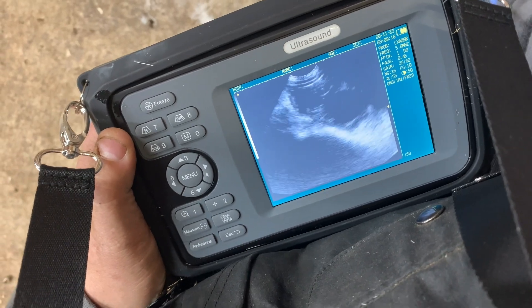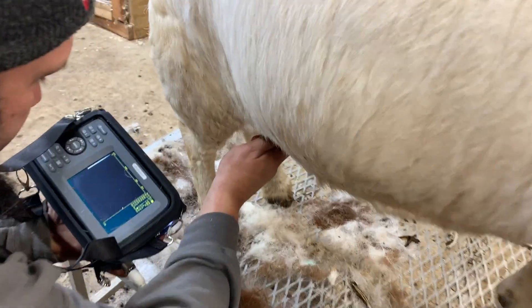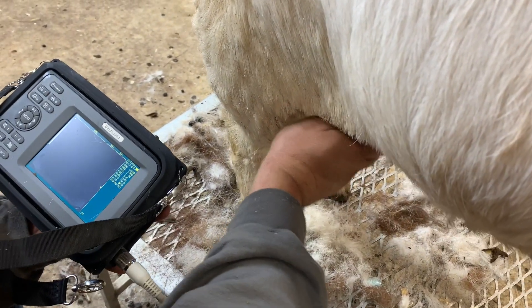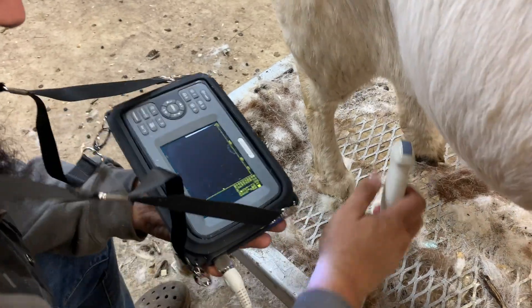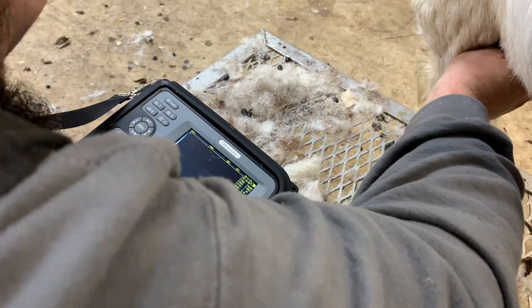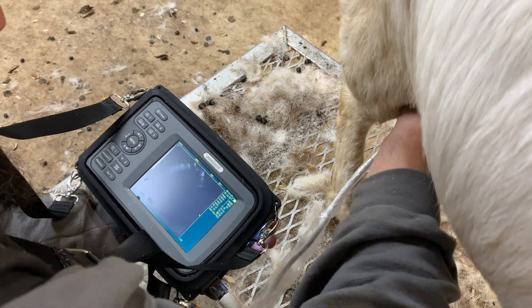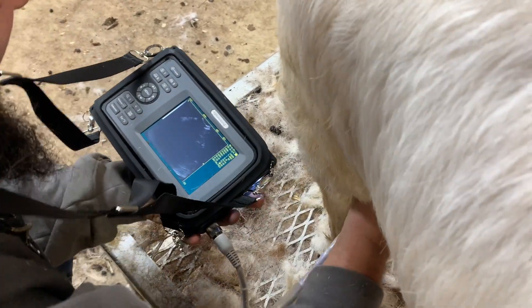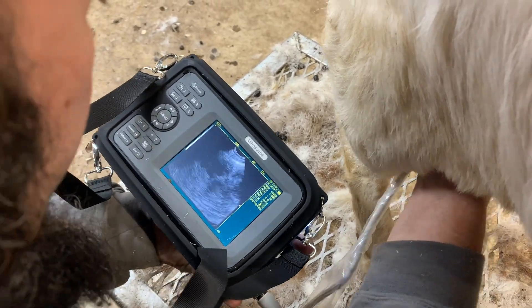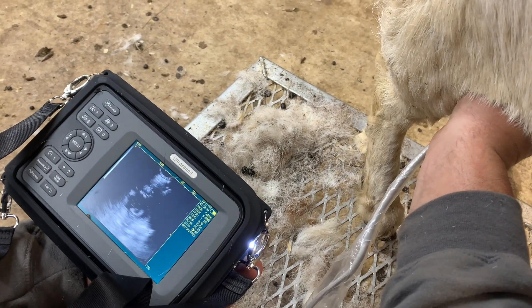That one spot I just don't know about it — right there, what's that? Yeah, that's the one spot I'm putting on. Half my lube fell off so we'll use some of the hand sanitizer. I'm going to push her over on the other side. There — looks like it got good contact. There, looks like it.